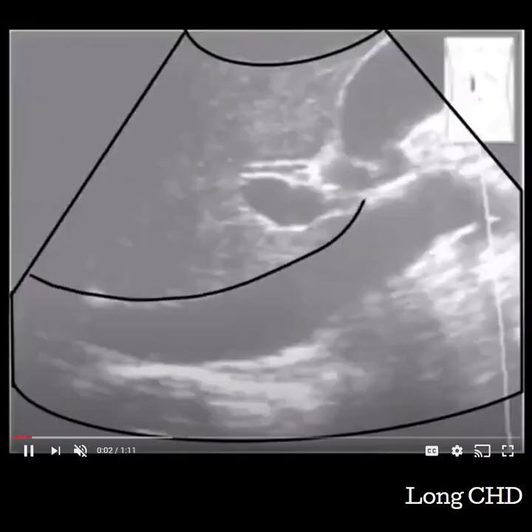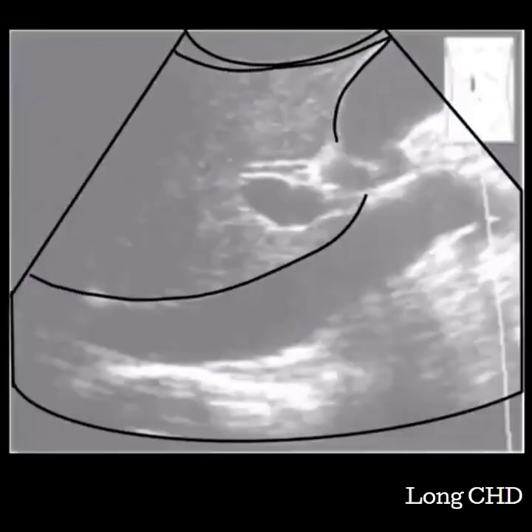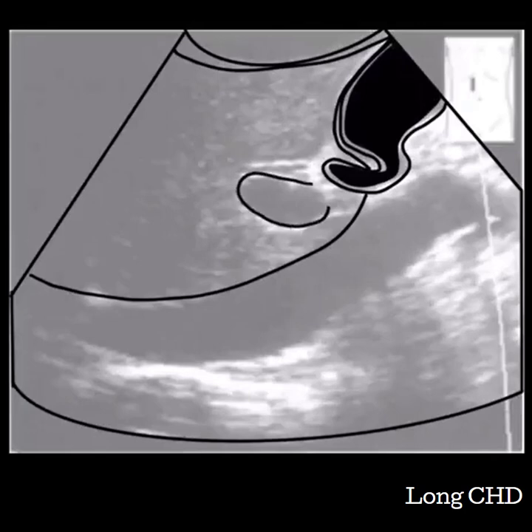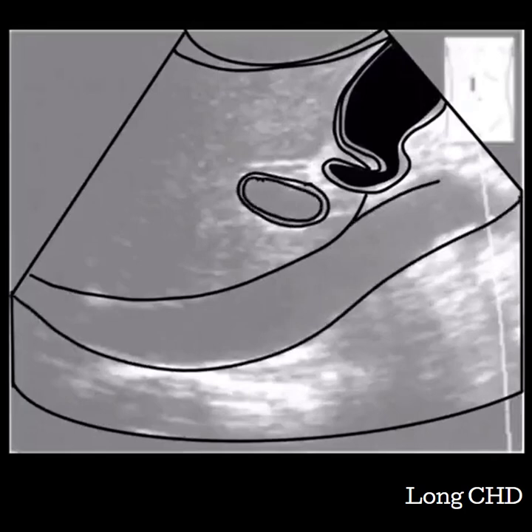Remember now that the goal is to visualize the common hepatic duct to the best ability, so make sure that you are zoomed in, making the common hepatic duct the focus of your image. You will see liver surrounding the common hepatic duct, showing that you are inside of the liver and truly measuring the common hepatic duct. Use your color box to differentiate between vessels and the ducts.